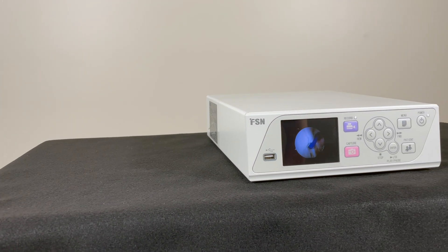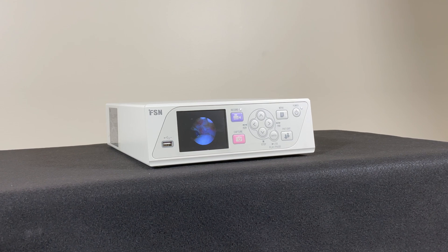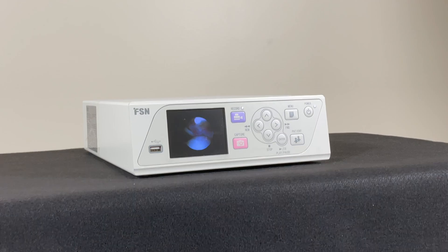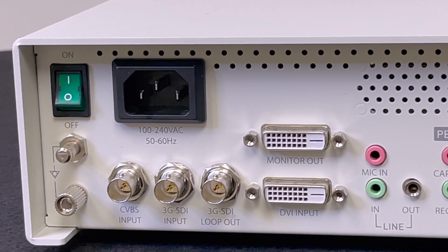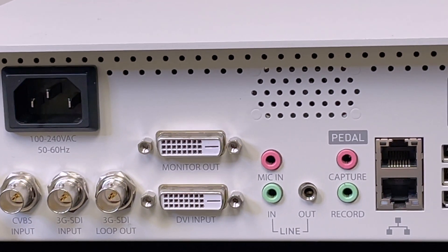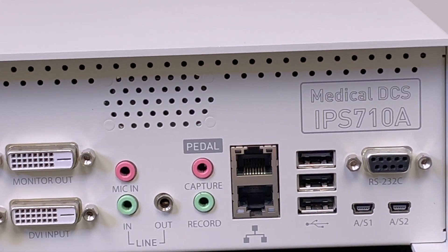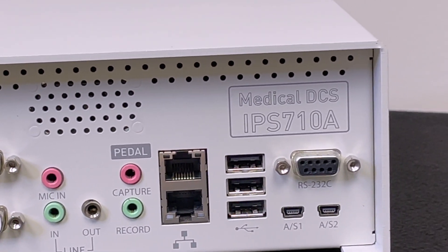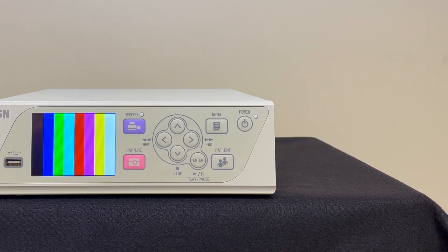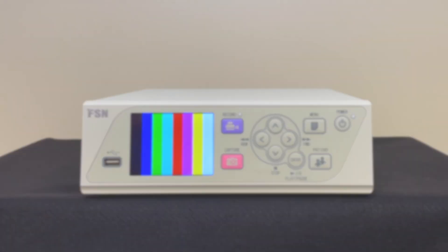The IPS710A by FSN Medical Technologies is the all-in-one medical video recording system. Lightweight and portable, this recording system features a straightforward setup, internal and external storage options with the ability to record in 1080p high definition at 60 Hz. Capture both video and stills simultaneously, manage your recording through the front-facing buttons, add a touch screen for additional controls, or use FSN's VAX software.